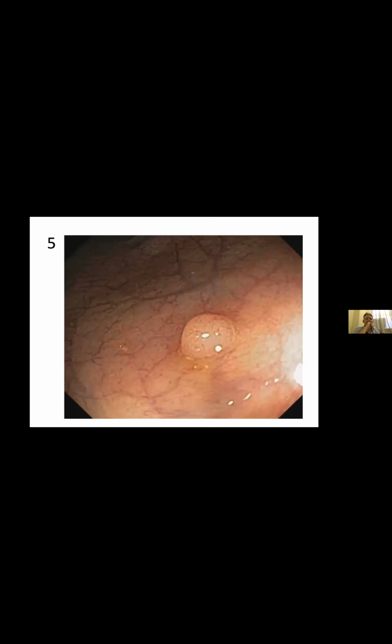This lesion over here is another hyperplastic polyp. And there you can go and look in your own time. If you look at the Kudo classification, you can see how to recognize them. It becomes very easy after a while to recognize hyperplastic polyps. But if you're not certain, if ever you're in doubt, remove them, and write on your pathology report, I think this is a hyperplastic polyp.